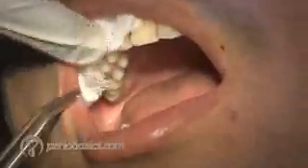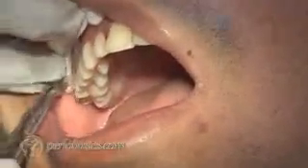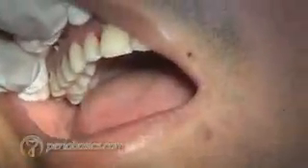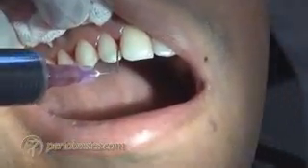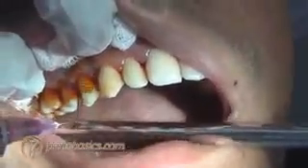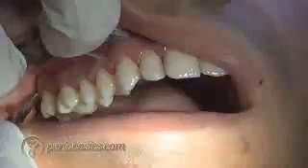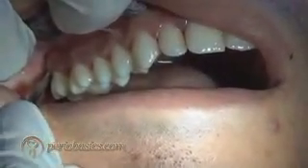And first of all, we isolate the area with the help of gauze. Here you can see the isolated area. Now we irrigate the area with antimicrobial solution. We are using povidone iodine in this case. And then we start with the internal bevel incision.